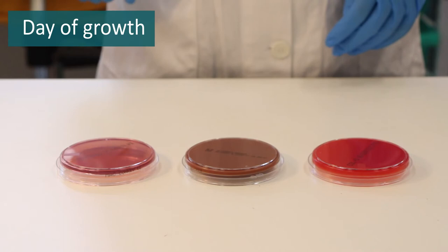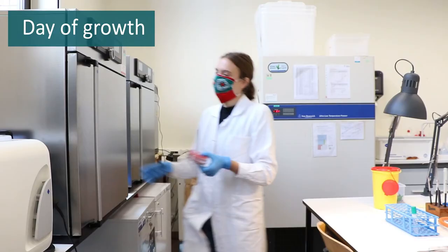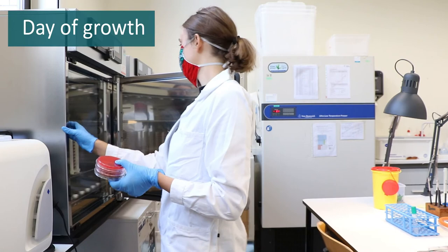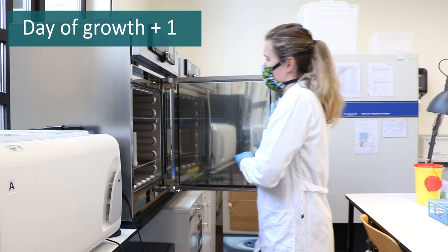Selective media only allow growth of a specific group of bacteria and inhibit growth of other bacteria. An example is McConkey medium with crystal violet, which only allows growth of gram-negative bacteria and inhibits growth of gram-positive bacteria. Inoculated plates are incubated overnight.